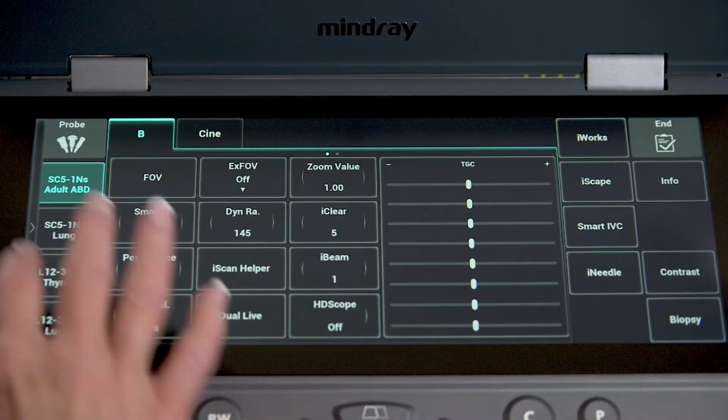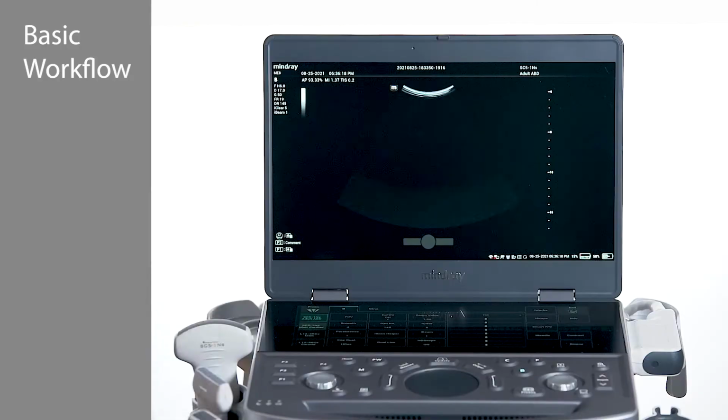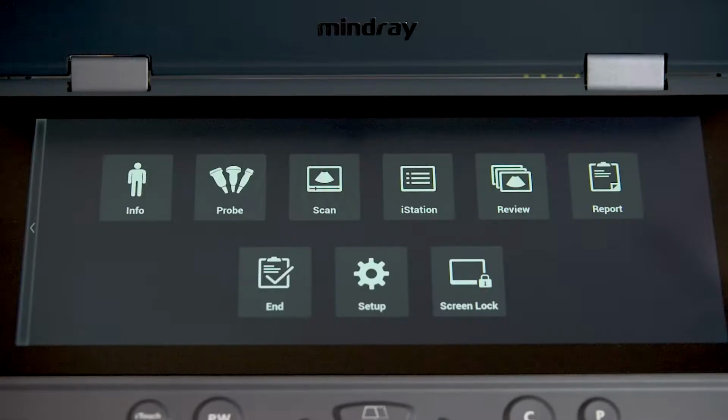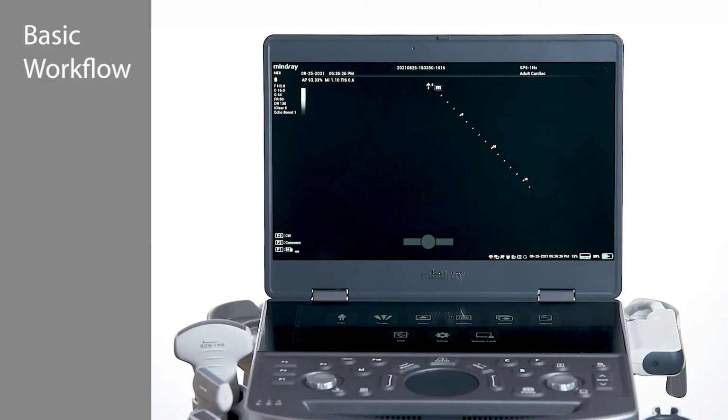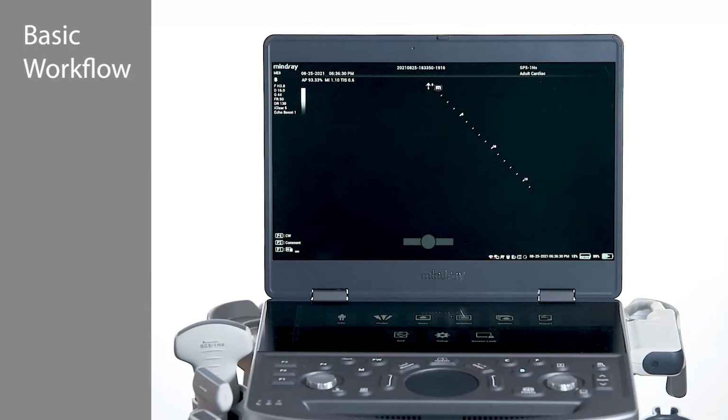Return to basic workflow tabs by either tapping or swiping the white arrow icon. Any images or clips taken during the exam may be reviewed with the Review tab. To access any measurements taken, tap the Report tab to see or edit any measurements. Once the study is completed, press End.